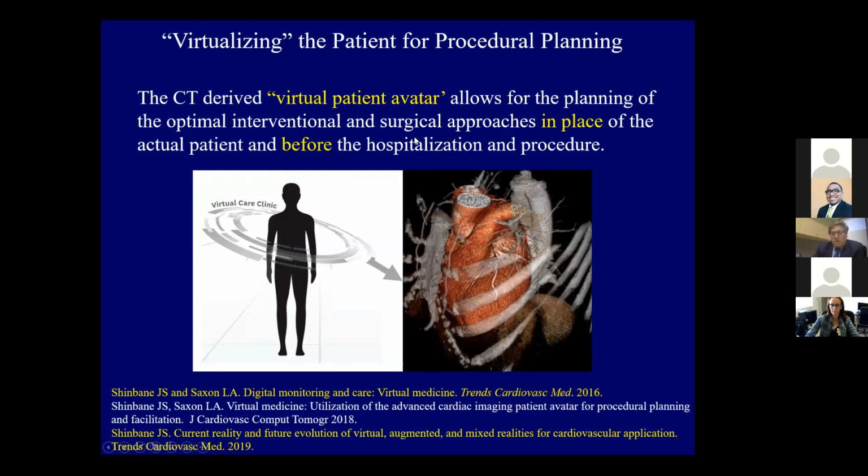So the patient gets an outpatient CT scan. Again, the scan takes 3 seconds. The images can be processed to this form very quickly. And then while the patient's at home, we're planning the procedure virtually in a multidisciplinary format.